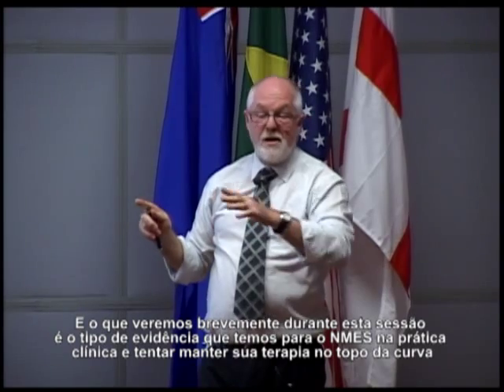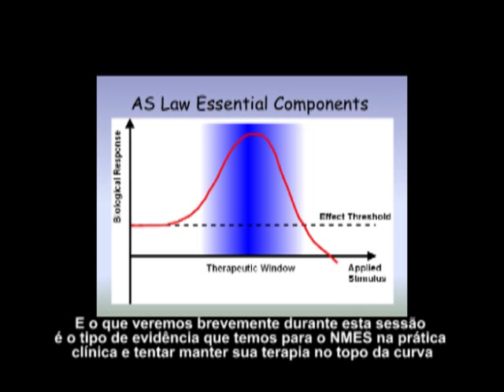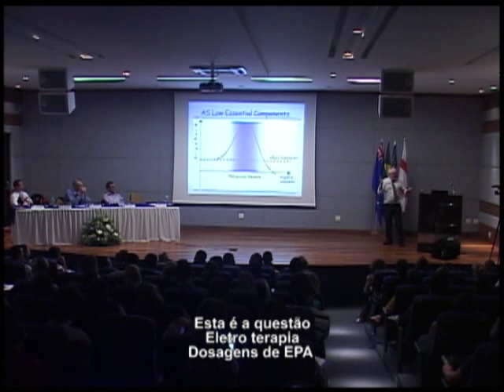And what I'll look at briefly as we go through this session is the kind of evidence we've got for NMES in clinical practice and how to try and keep your therapy at the top of the curve. This therapy has an effect, but it's not optimal. We choose, by choice, we should be up here. And that's all the issue is about electrotherapy: the dose is to get you to the top of the curve.